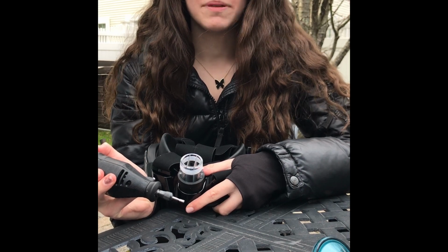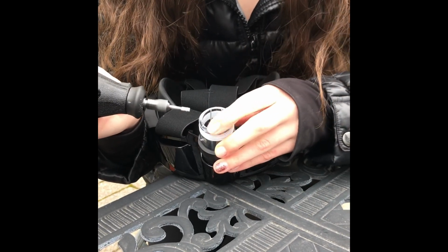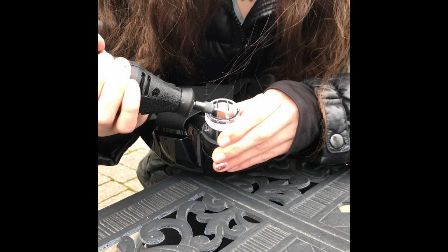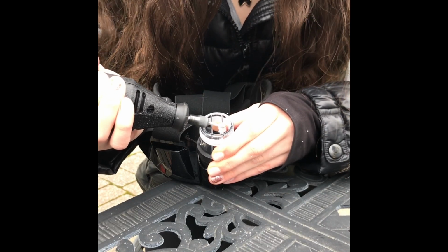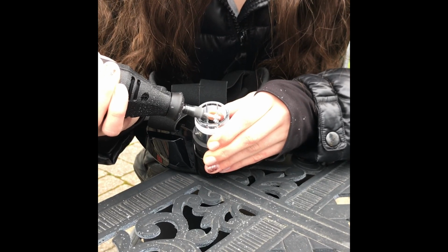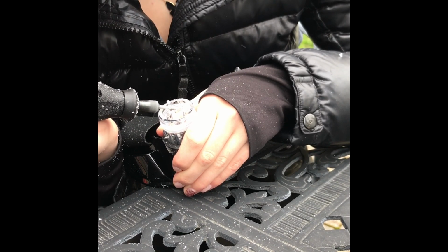I would recommend wearing eye protection so the plastic does not get in your eye. You're going to turn the Dremel on a low setting, and you're going to begin on the sides. And you're going to want to try to avoid the outside piece so that the seal still fits. As I finish up drilling, as I get to the end, I'm going to want to test to make sure the filter fits properly in the snorkel area.